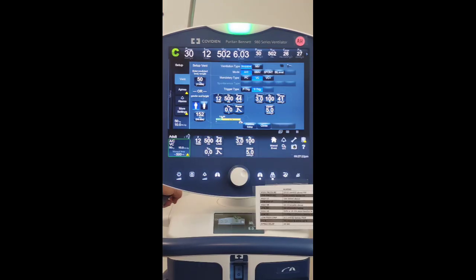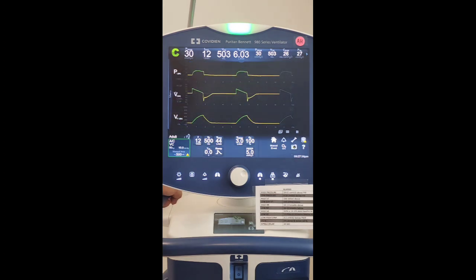So I want to meet my minute ventilation need. What is normal minute ventilation? 5 to 8 liters per minute, or 5,000 milliliters per minute. So I did the calculation, 6,000 milliliters per minute divided by the 500 milliliters that I'm giving the patient. It comes up with a rate of 12.